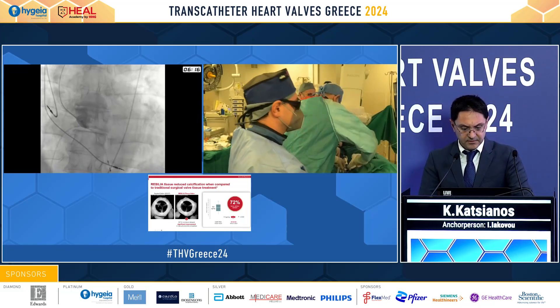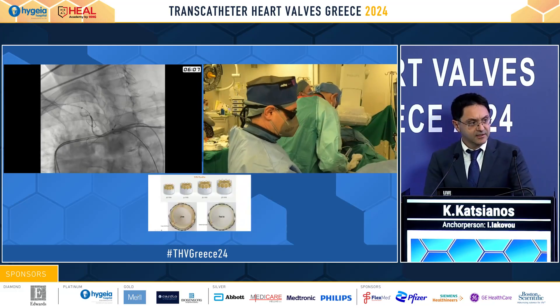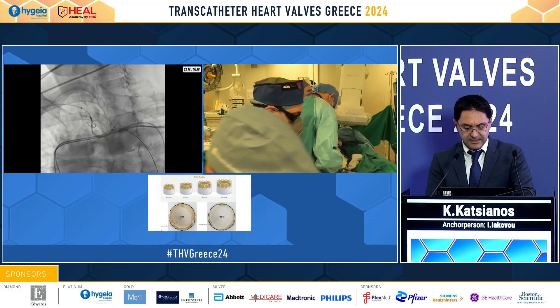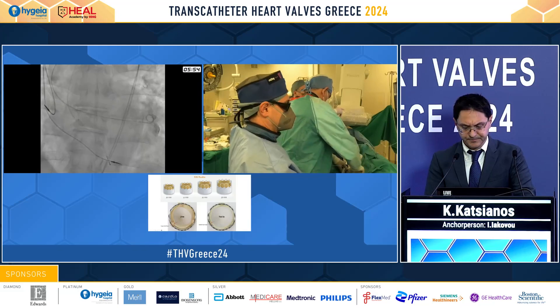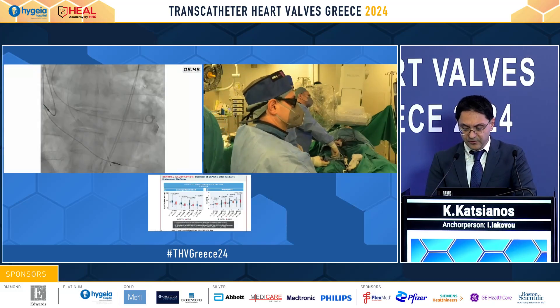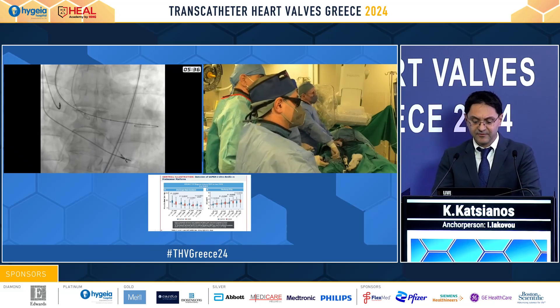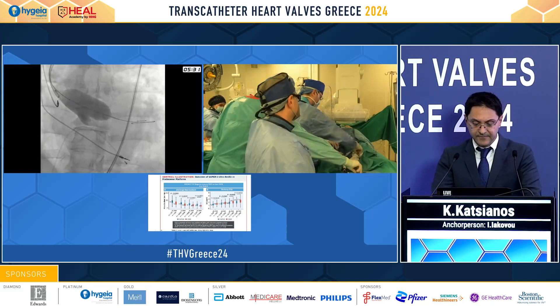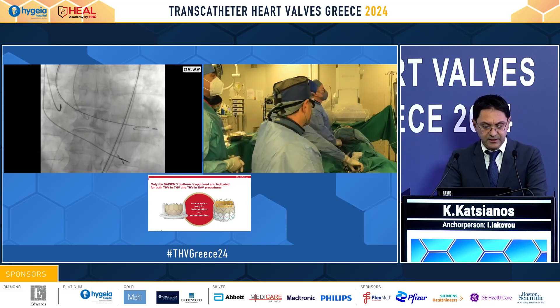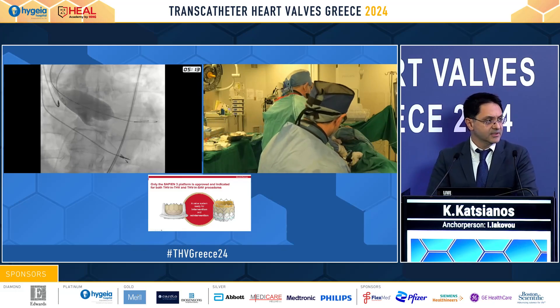We also see a mild to moderate regurgitation. We wanted initially to place sentinel protection, but due to anatomical reasons — the anatomy was also calcified — we decided it was not in the favor of the patient. We checked the pigtail position before placing our extra-stiff safari wire, and now we see the valvuloplasty with a 25mm Edwards balloon.